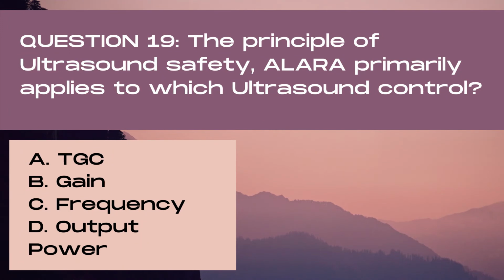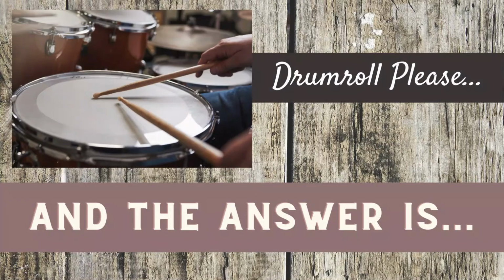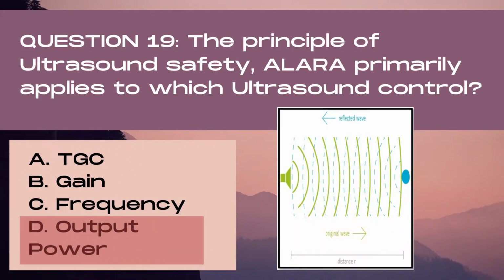Question 19. The principle of ultrasound safety, ALARA, primarily applies to which ultrasound control? A. TGC, B. Gain, C. Frequency, or D. Output power? And the answer is D.